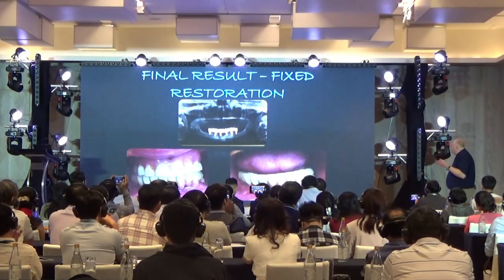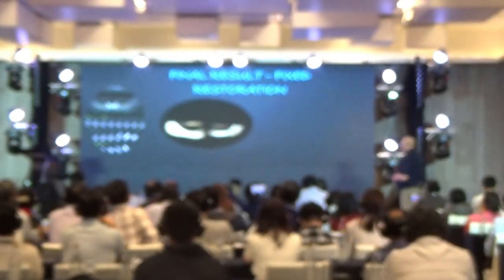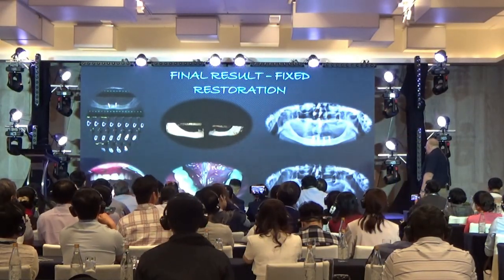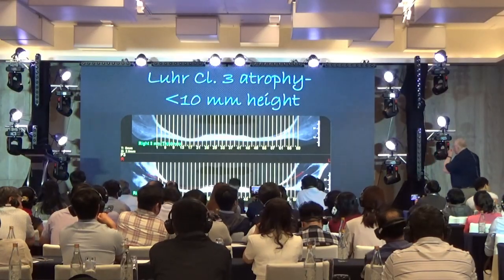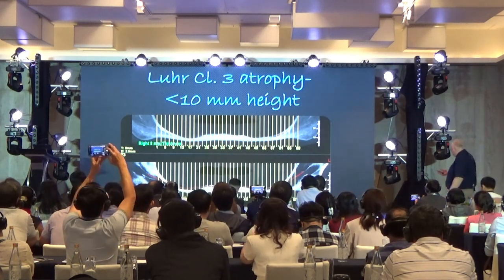So you know, sometimes crazy things happen. And another example, again, fixed from 5 implants. And I think this will be the last case for now. Again, less than 10 millimeters high.